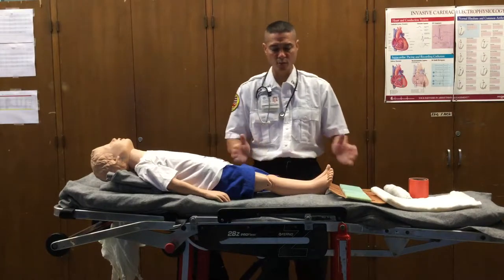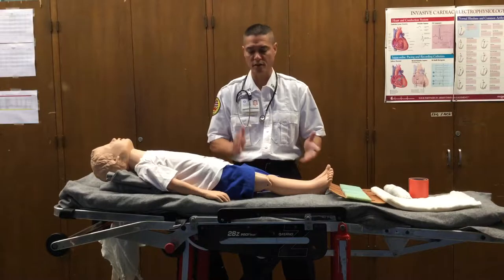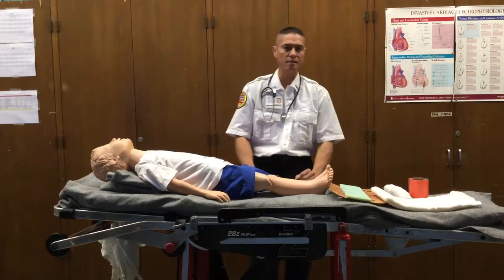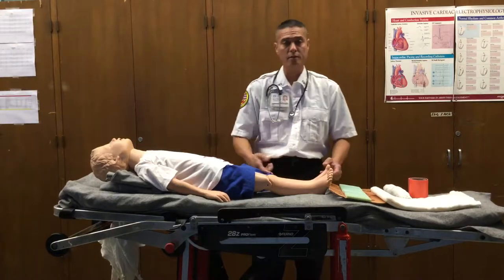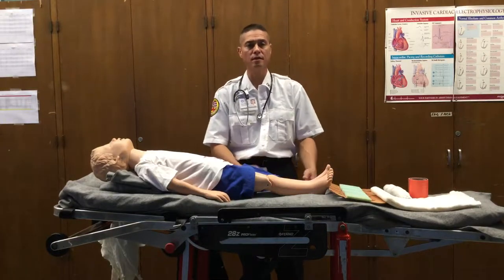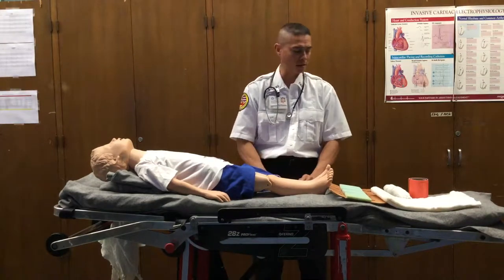Let's go over splinting. Splinting is supposed to immobilize sprains, strains, fractures, and dislocations because we're unable to identify whether or not there's an actual break or fracture in the continuity of whatever extremity or bone we're looking at in the pre-hospital setting — that requires x-rays in order to determine such.